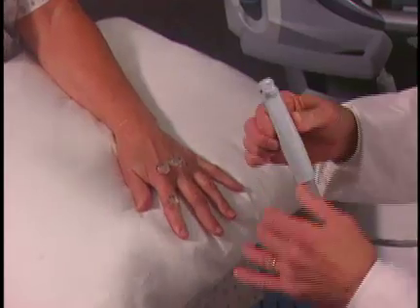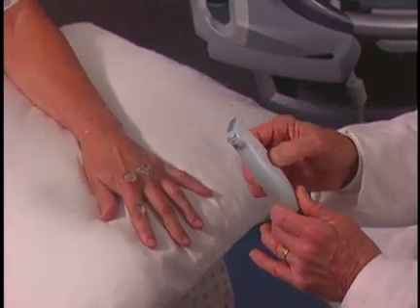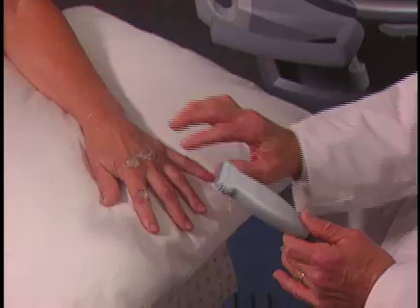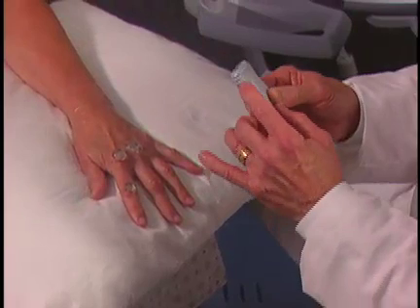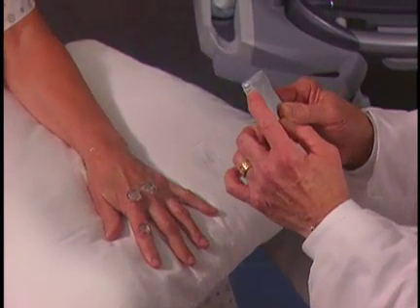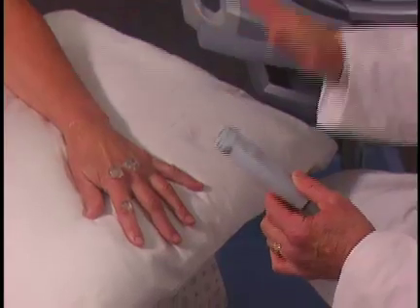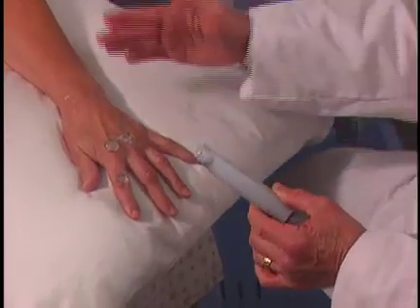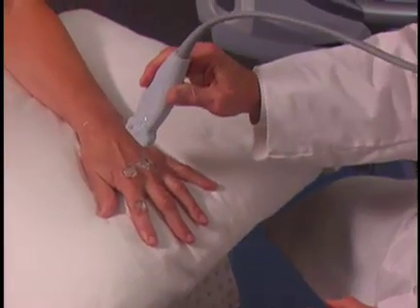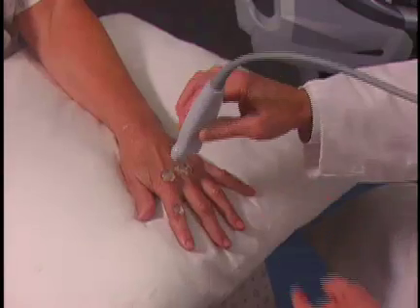The best transducer for this exam is the L25, which has a small footprint and allows you to retain contact with the skin surface. There is a marker on the transducer which represents this turquoise dot. To keep your orientation straight, you always want to keep this proximal for longitudinal images, and medial — so this marker should be on the outside.